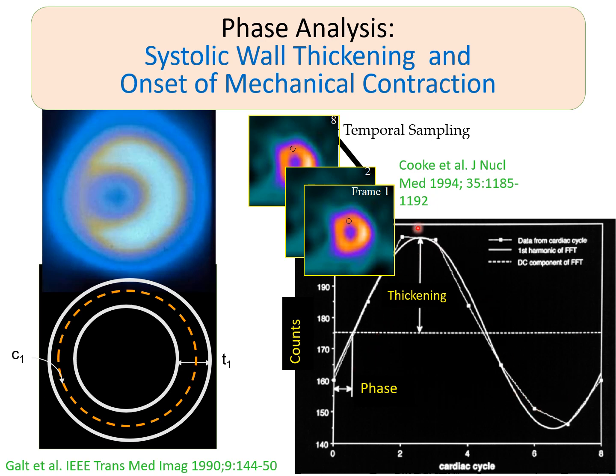Now, the reason that this is true is because we use the partial volume effect. I'll show you a couple of phantoms, but this one here is just a phantom where we have an eccentric chamber. So this is supposed to represent the LV with thick myocardium and thin myocardium, filled with the same concentration. But as we go around that myocardium, we have determined that the change in counts is linearly proportional to the change in thickness.